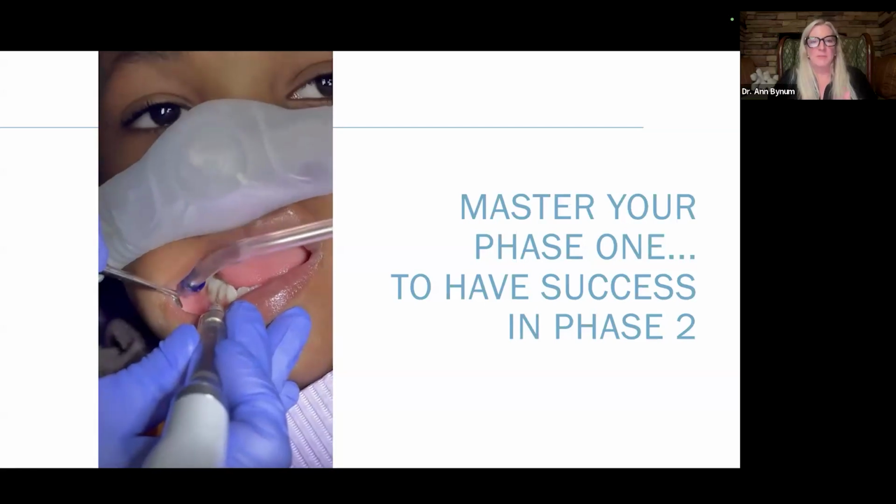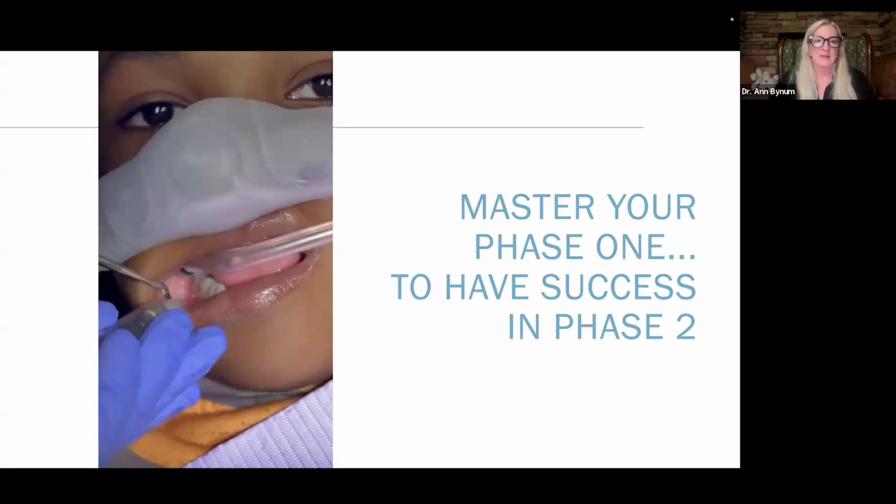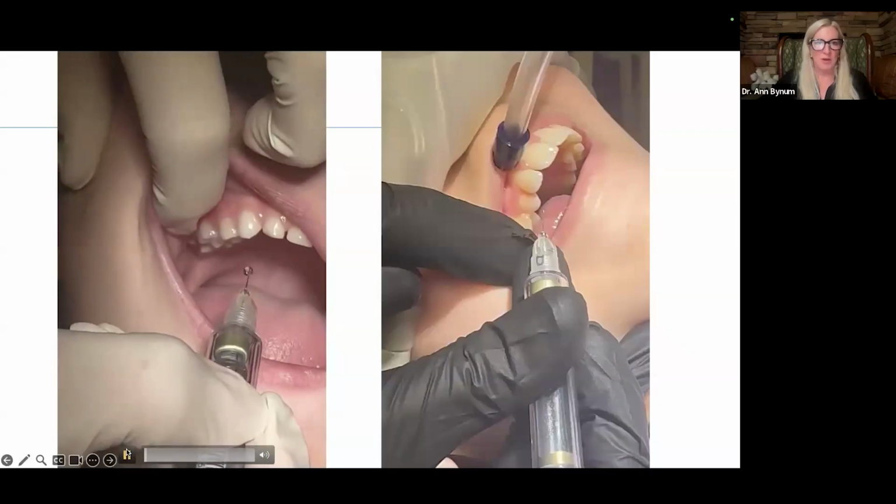And you just want to leave it. People say, how long are you leaving it in? Well, I don't know. Some kids it'll blanch in 5 seconds. Some kids it'll blanch in 10 or 15 seconds. You just need to have the agency to decide how long you need to leave it in for each patient. So here are a few videos showing stage 1.